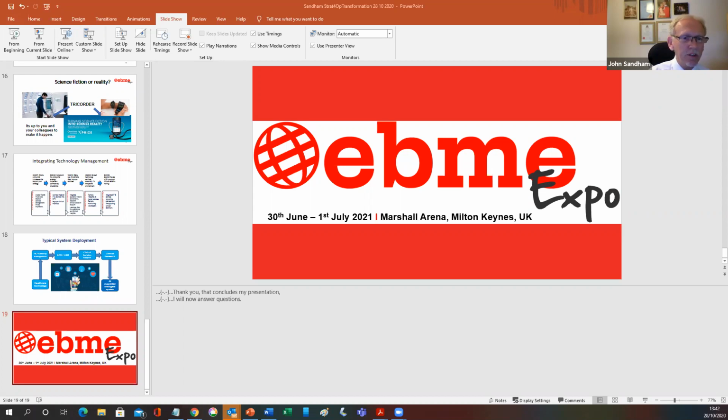Gabrielle, I'm curious about how long it will be until most of the medical devices being used for the assessments of patients are fully integrated into the EPR. Are medical device manufacturers according enough attention to integrated systems? The manufacturers definitely are giving enough time and ensuring that the devices can be connected. All medical electronic devices now have HL7, Health Level 7 software built in, so that they can be integrated into other software systems. And there are a number of middleware providers who can connect to the HL7 and transfer that data safely into the EPR.